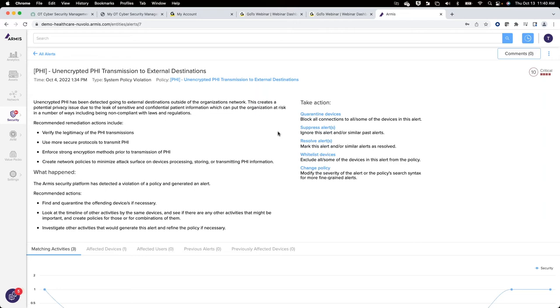And you have a process to capture the remote radiologists that have their workstations at home and remote offices and things like that. So that would need to call back home, right? Again, we need to see that traffic. So as long as we see the traffic, yes. If we don't see the traffic, is there a way that you're, is it calling home somewhere? Is there a third party solution that those remote devices are coming back into that are being tracked? Well, if we see the traffic, then yes. Yes, we can.